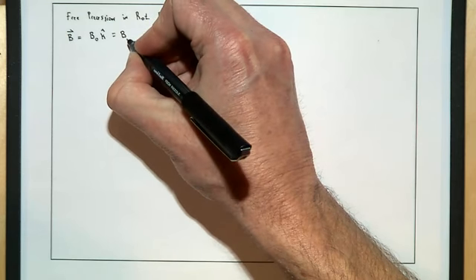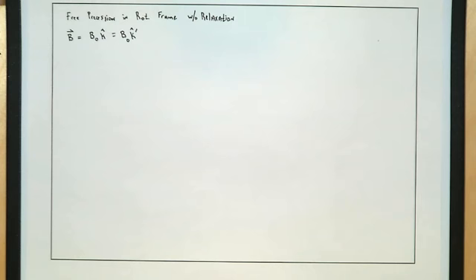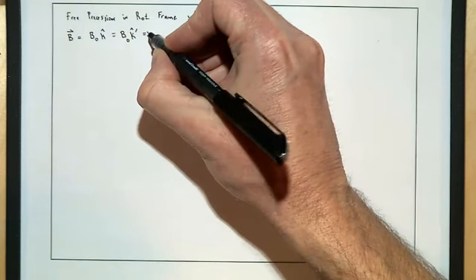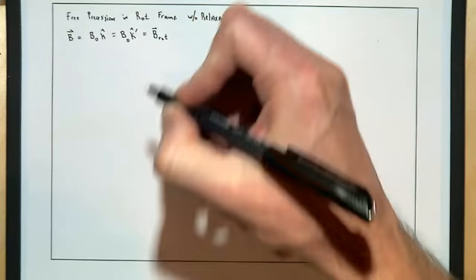It's still B0. It points, you could say, along a different direction, just the K prime direction. But in the laboratory frame and the rotating frame, they share the K direction, right? Everything's precessing about Z. Nothing has changed in terms of components along the Z axis. And so in that so-called rotating frame, it's just the same B field.